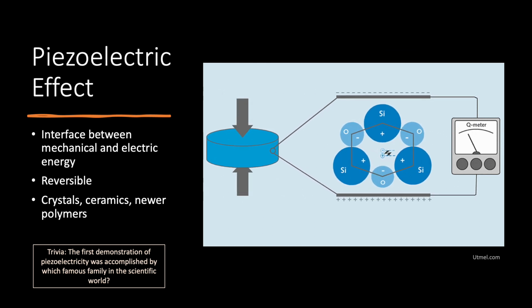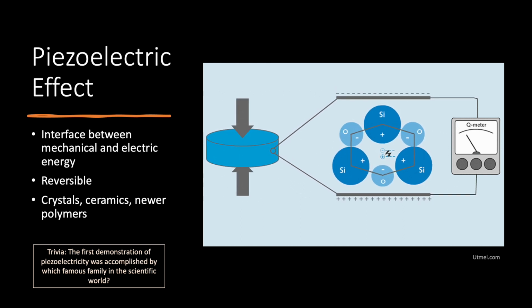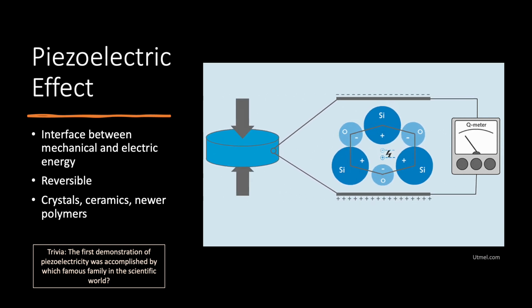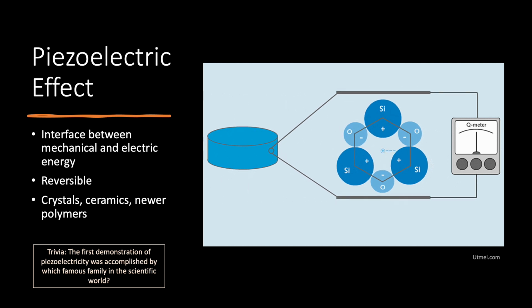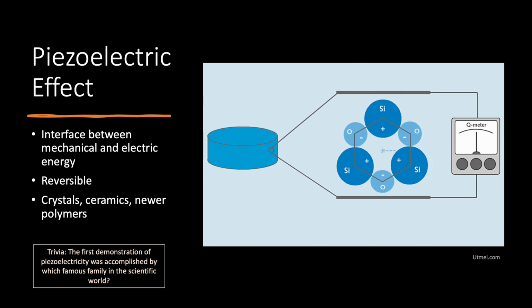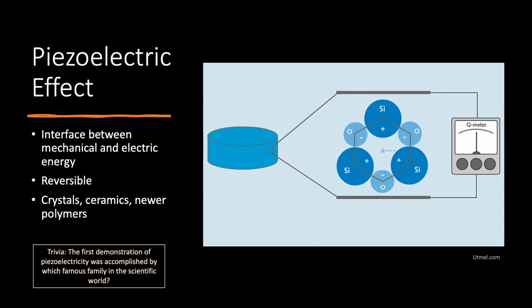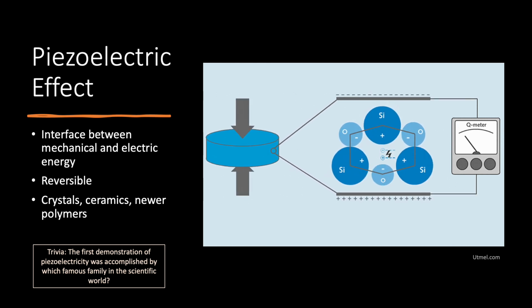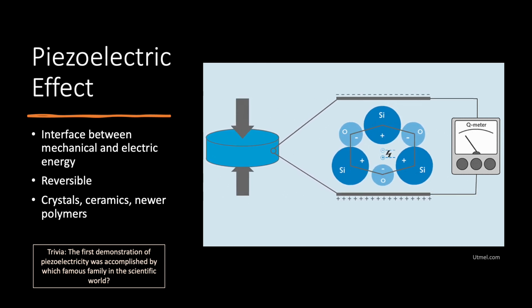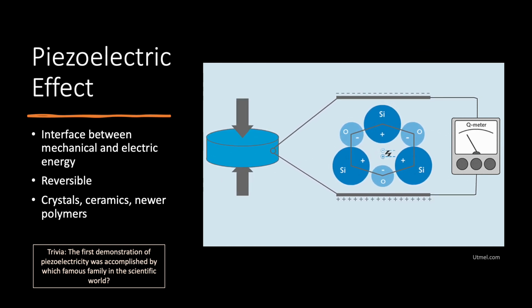This phenomenon is used in a variety of different applications, not just ultrasound. So we use them in sensors and actuators, but we definitely use them inside our transducers. And it's key that we understand this because this is how we convert mechanical energy to electric energy and vice versa, which enables ultrasound to be a great medical diagnostic tool. And then a fun piece of trivia is that the piezoelectric effect was first accomplished or first demonstrated by the Curie family, the same family that gave us Pierre and Marie Curie. In fact, Pierre was one of the two scientists credited with this discovery, although it had been postulated and theorized prior to his demonstration of it.